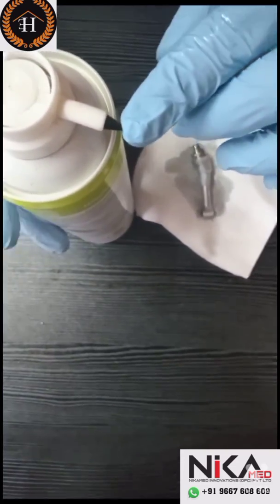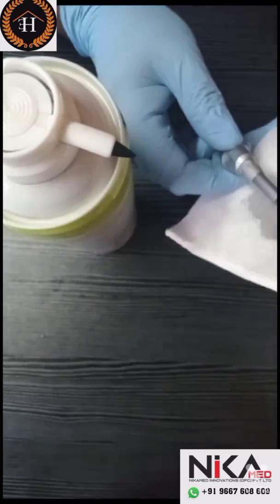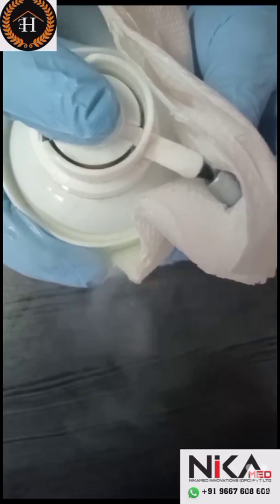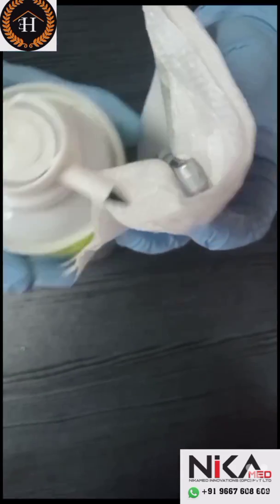Remove the F-type nozzle. Now take the handpiece, cover the head with tissue, keep your forefinger on the head, press the spray with full pressure, and simultaneously press the headcap. The handpiece is now lubricated.